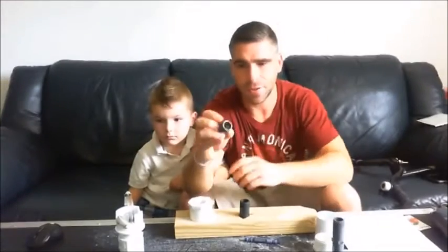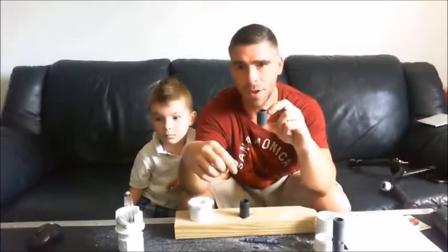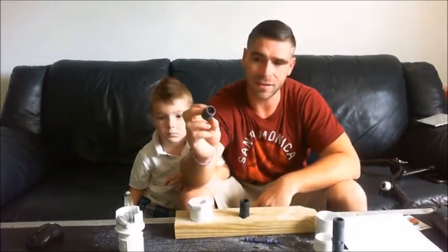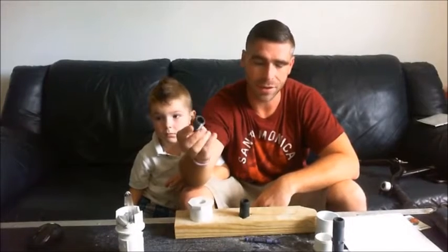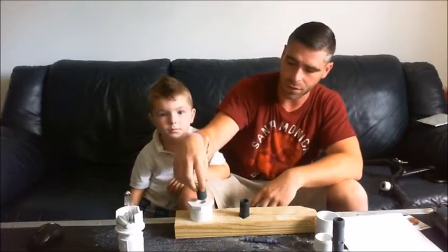Next, we're going to take a 3 quarter inch by 1 and 3 eighths inch threaded male PVC pipe. This comes in a variety of different sizes and based on your need, you can go much longer than this. This is what Carter needs.